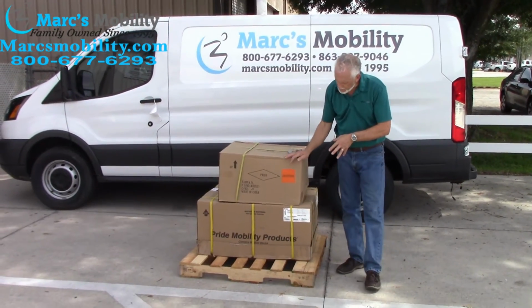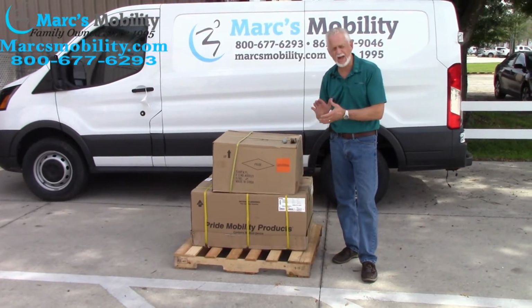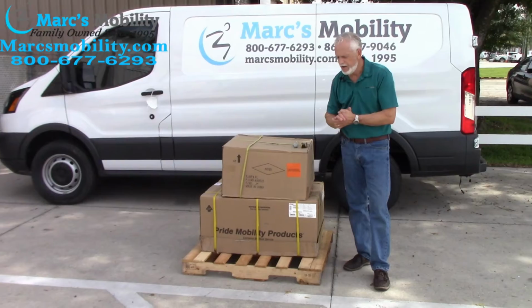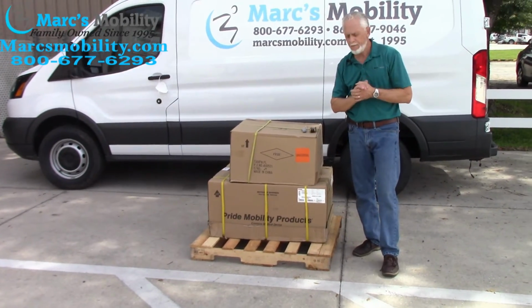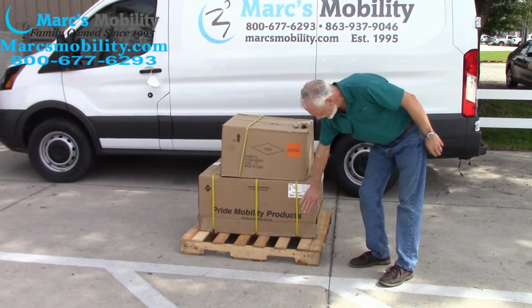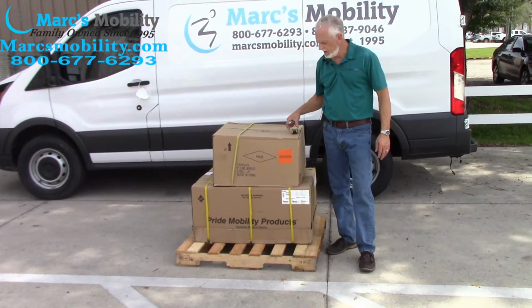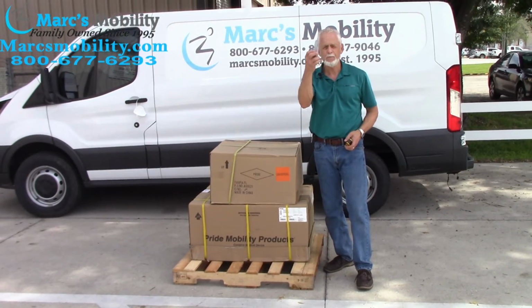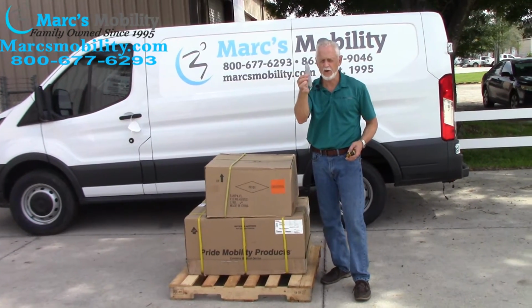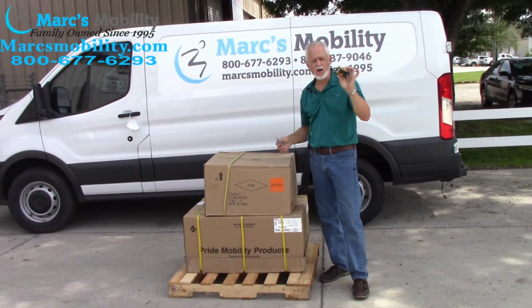We have here a Jazzy 600 ES power chair. So if you're getting a Jazzy 600 ES power chair, when it's delivered to your driveway, this is what it's going to look like. The seat will be in this box. The chair will be in the bottom box. The only thing you need is a box cutter, if you have one, which would be the easiest way to go, and a set of Allen wrenches to just tighten up the arms on the power chair.